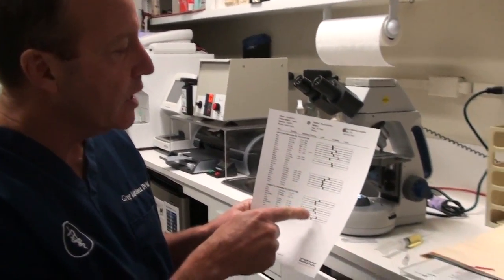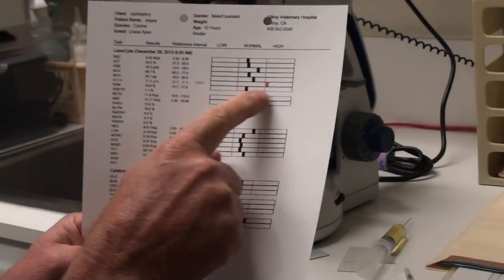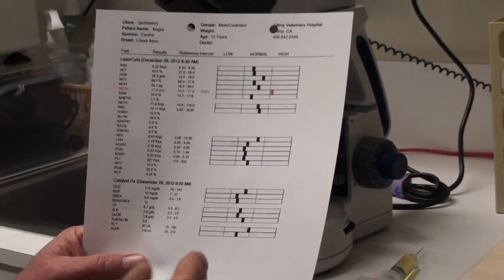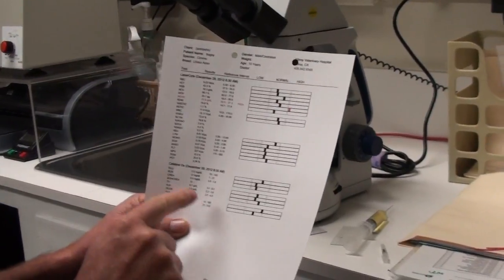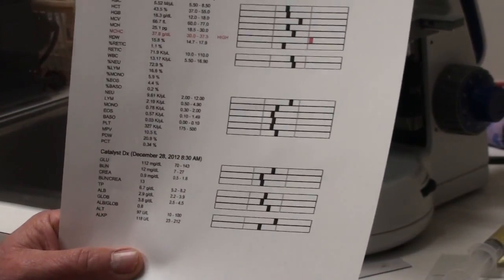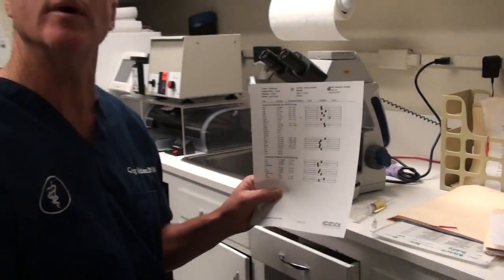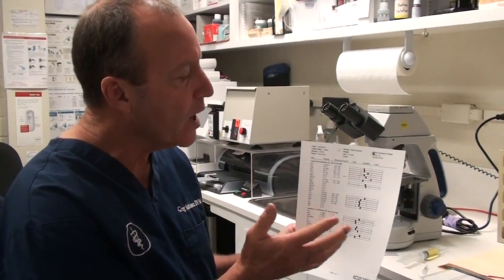Bogey's blood work looks good. We drew Bogey's blood and we can see that his white blood cells and red blood cells are normal. Sometimes you will get one right slightly out of range, but that's not enough to cause any problems. The preoperative blood panel, which is a smaller panel we use to check the internal organs, shows that his glucose is normal — he's not diabetic — his kidneys are working great, his liver is working great, and he has enough protein in the blood. It doesn't show cancer or any kind of specific viral or bacterial infections; it shows us that the body's working like it should.